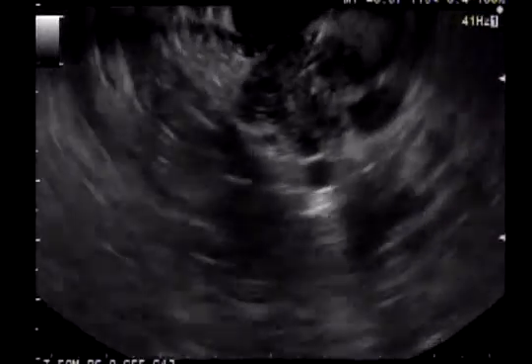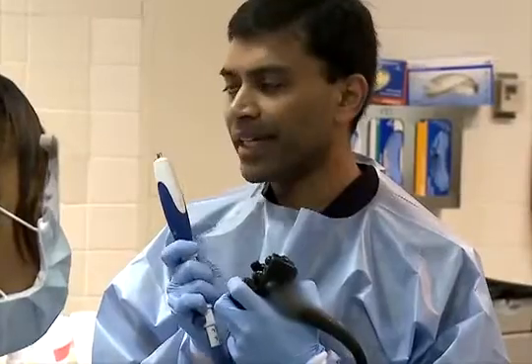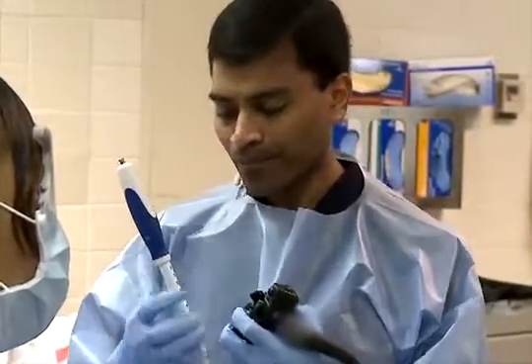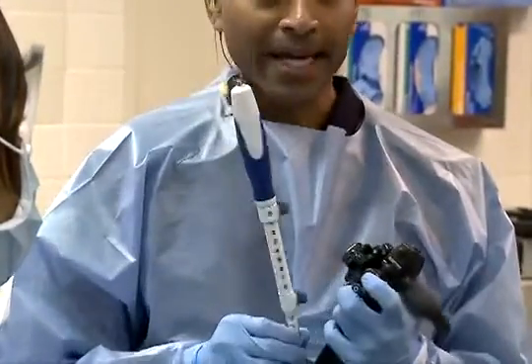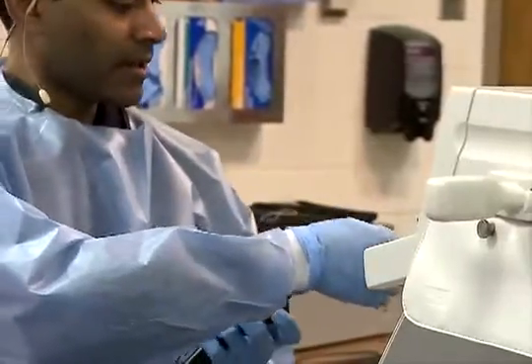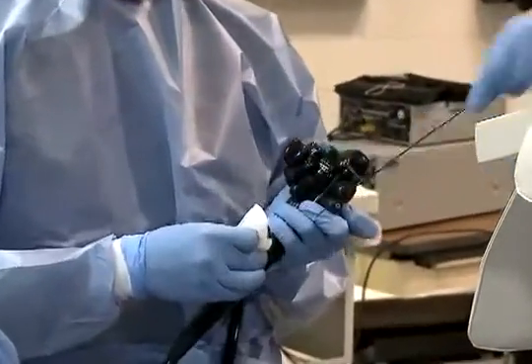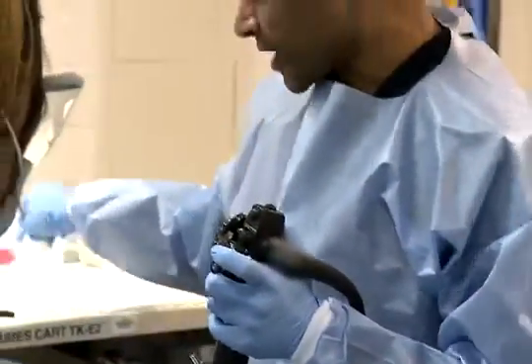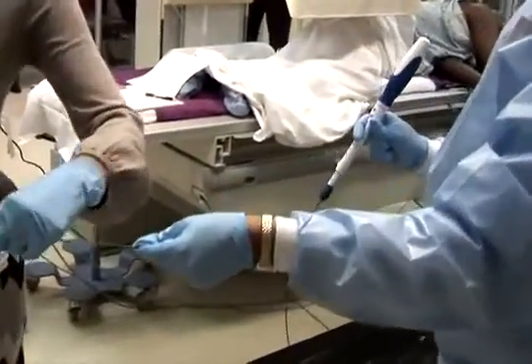It is very important not to have the needle outside the mass lesion for fear of contaminating the needle with the GI mucosa. Now, having completed my passes, I'm going to retract the needle back and disengage the needle assembly from the scope. So we've got pathologists in the room who assist us with all our procedures. Our cytopathology team is a very busy team, and now we are going to express the specimen onto slides.